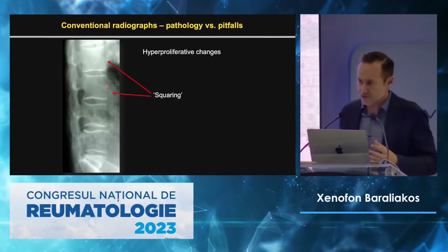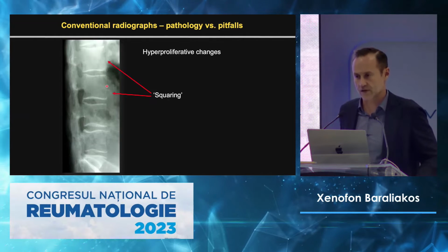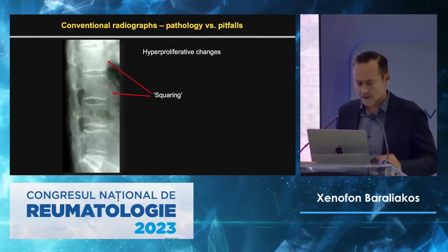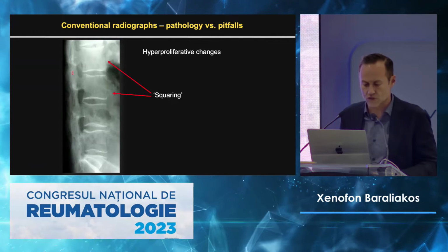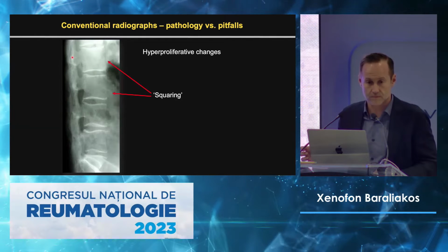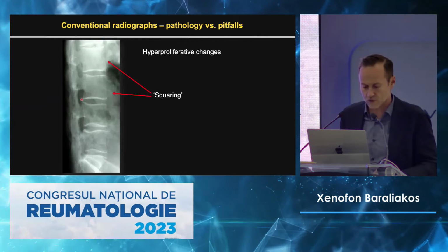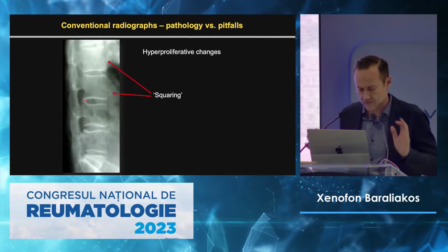Because there are different areas where the disease will go. Mainly it starts in the sacroiliac joints. Mainly it also causes syndesmophytes. But there is no other disease in the world that will fuse your facet joints that much. Yeah? So this is a bamboo spine, this patient cannot move. Yeah, he's completely fused. We have a posterior syndesmophyte, but that's just one of them, it doesn't really matter.